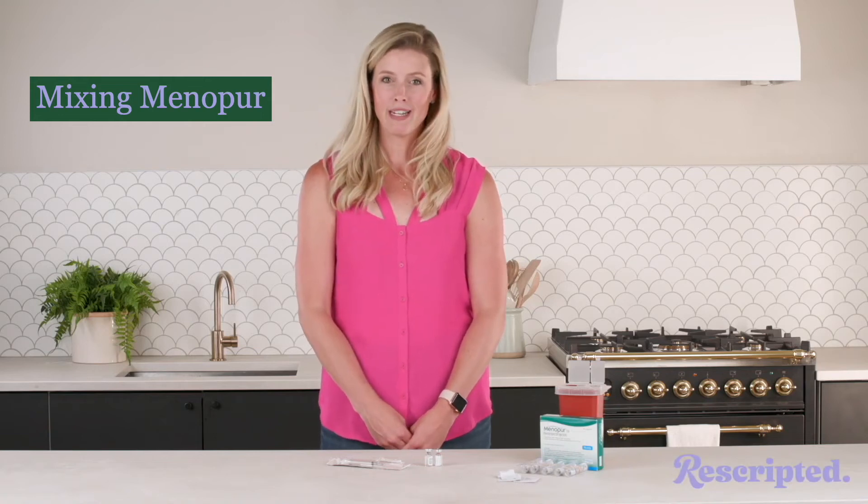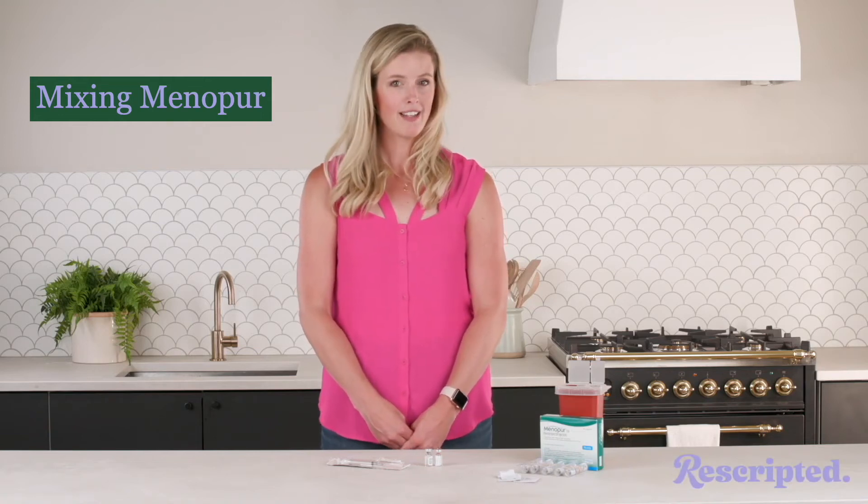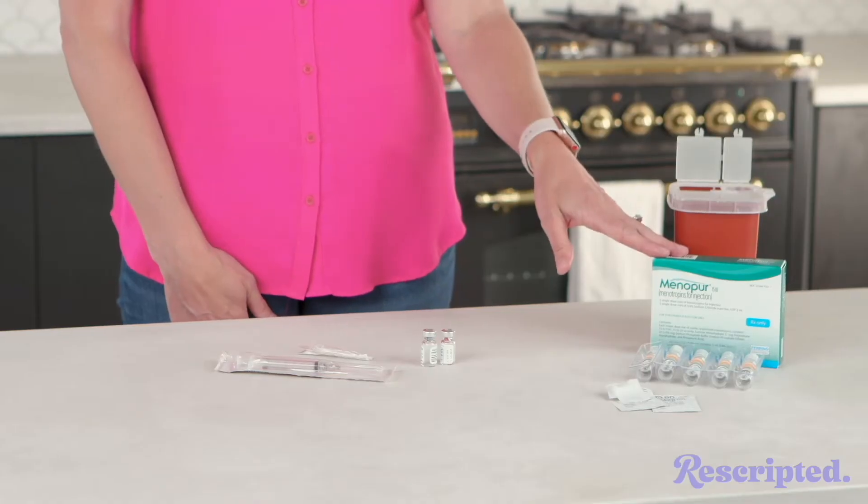Today we're going to learn how to mix Menopur. Here's your Menopur — you're going to start with that.